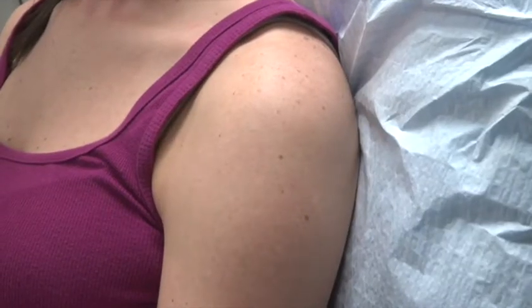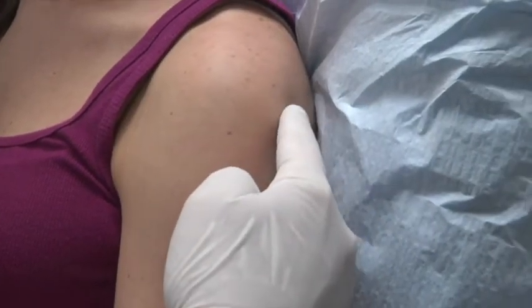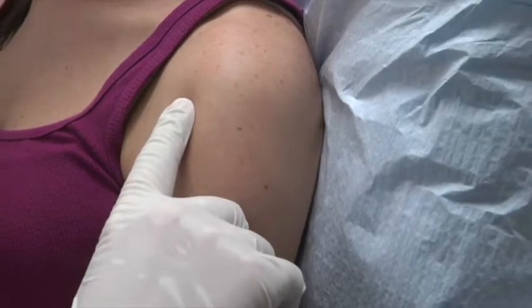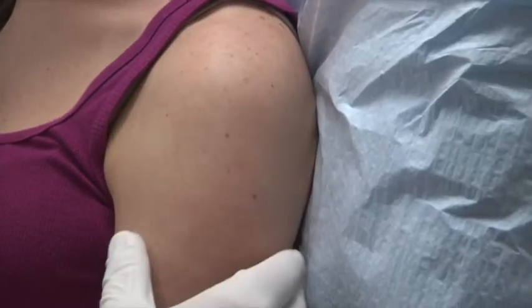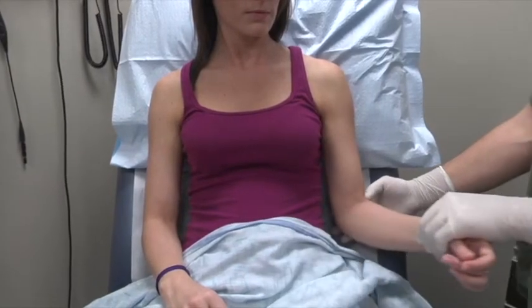The joint space of the shoulder can be accessed through an anterior or posterior approach. Both will be demonstrated here. For the anterior approach, the patient should be placed in a sitting position facing the clinician. The joint should be thoroughly inspected for signs of infection prior to the procedure. Slightly externally rotate the humeral head.